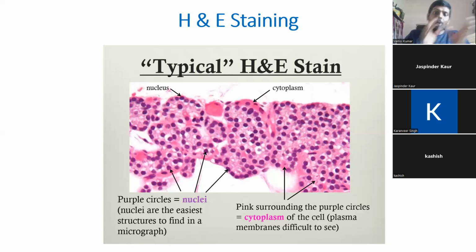It's a modified histopathology. Here we are not destroying the proteins, and we are trying to locate these proteins by using specialized antibodies. Hence this is called immunohistochemistry, and this is our subject actually.